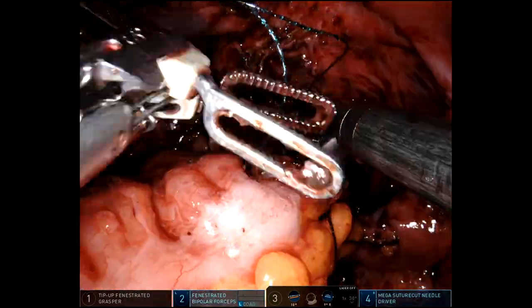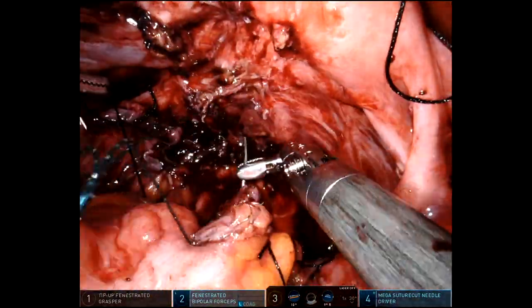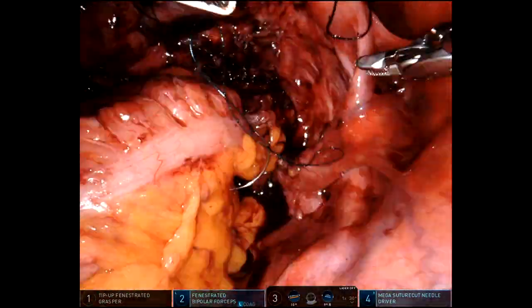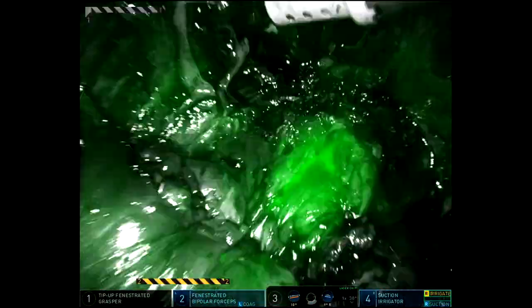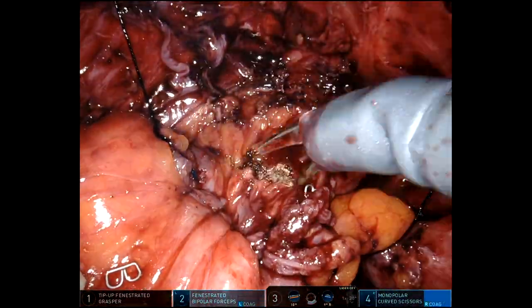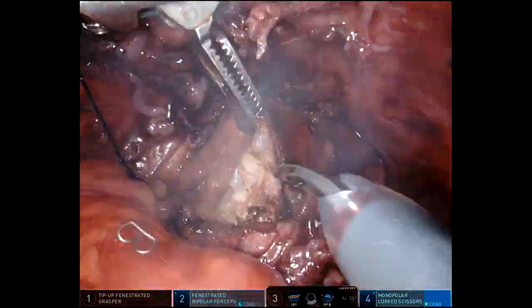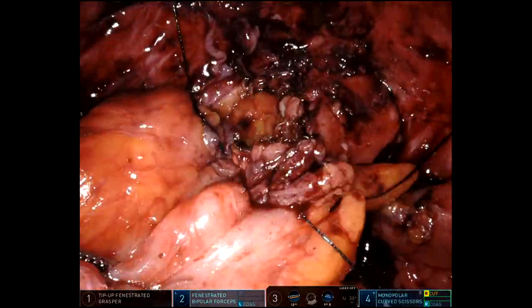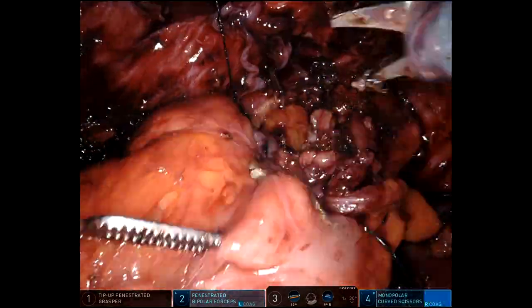I'll go ahead and suture the two staple lines together to form an outer posterior layer. I'm checking perfusion again to make sure I'm happy, which I am. Then I'll make a proctotomy with scissors and a colotomy with scissors.